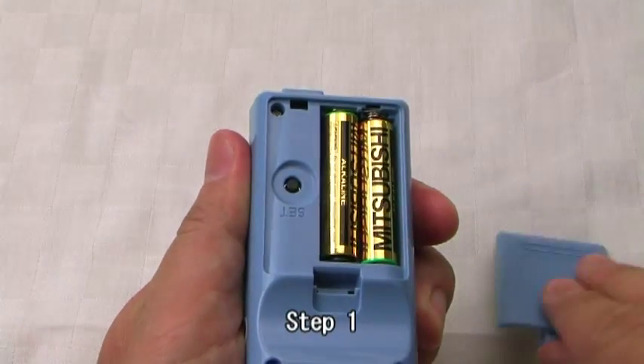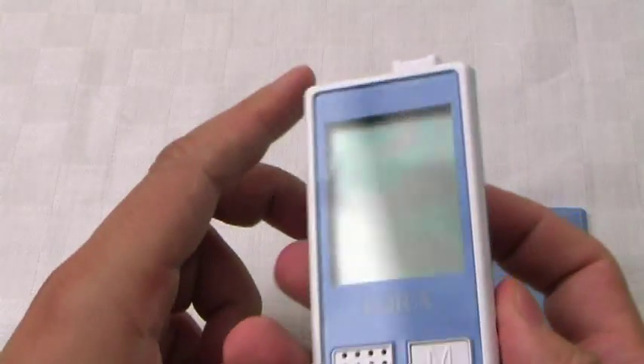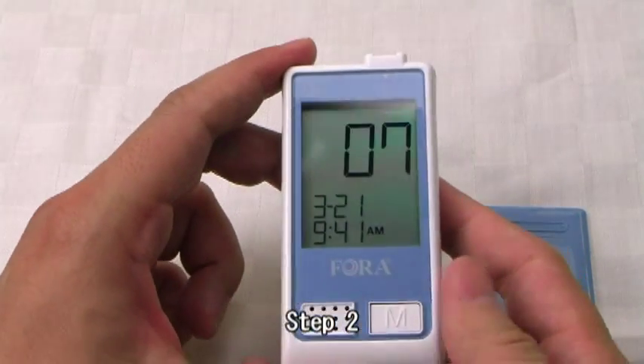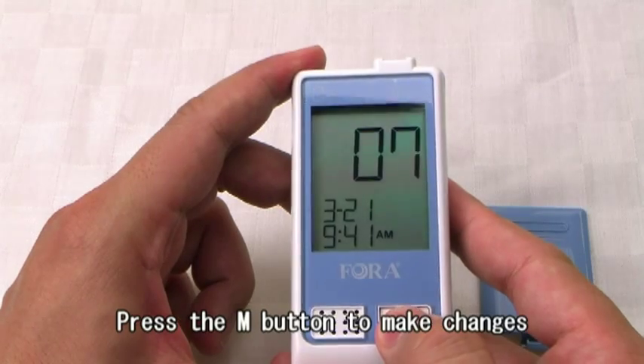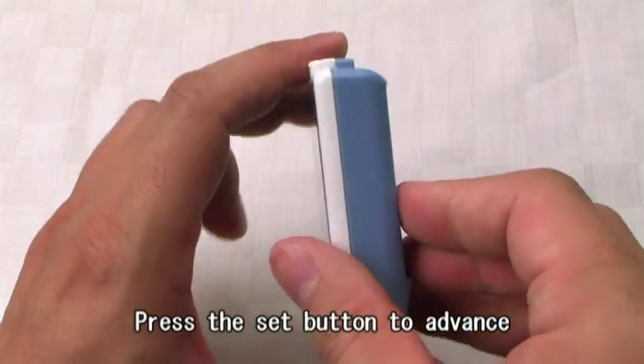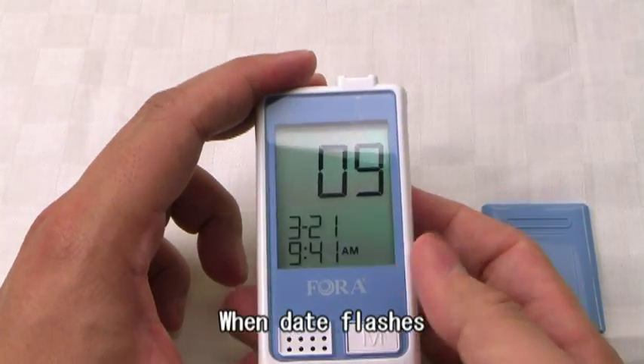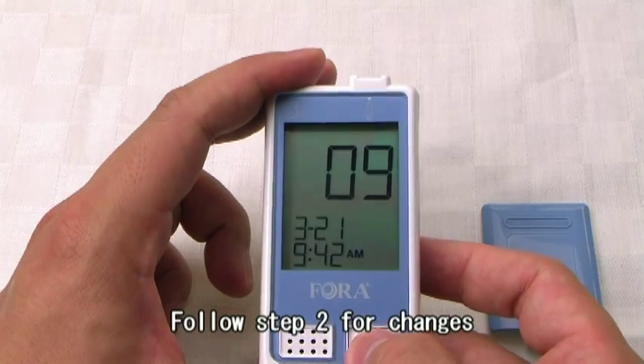Step 1: Press the Set button to start setting. The year flashes first. Step 2: Press the M button to make changes. Press the Set button to advance. When the date flashes, follow Step 2 for changes.